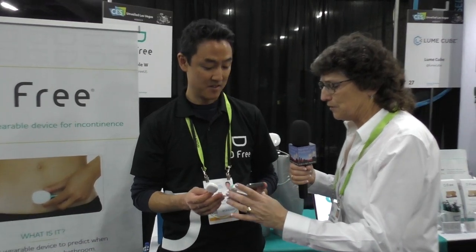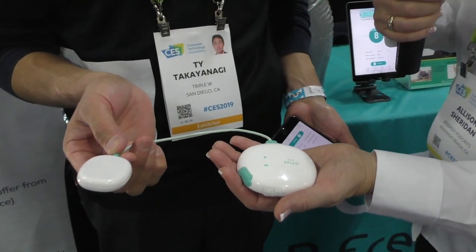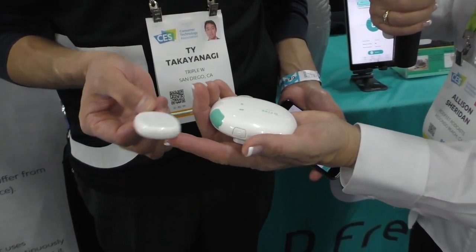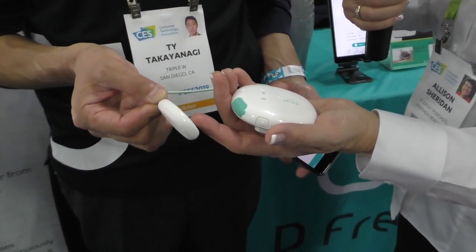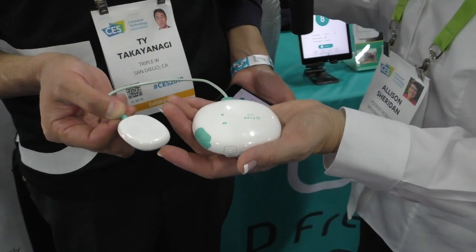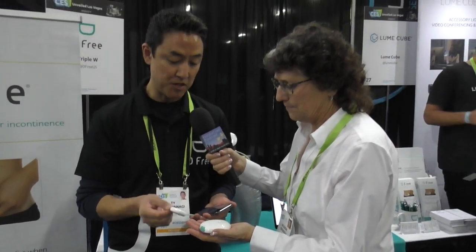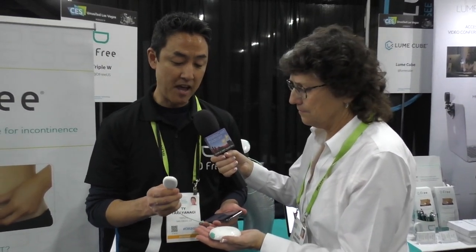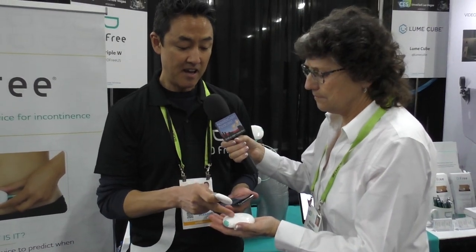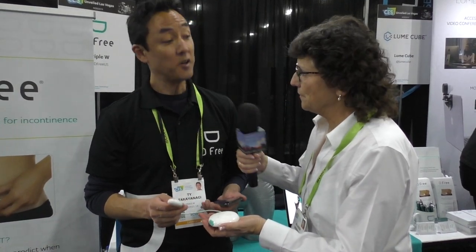Since this is an audio and video podcast, we'll describe these things. You've got two things in your hand: one is a puck that's maybe three or four inches in diameter, and then a little tiny sensor about the size of an Apple Watch, connected by a small cable. This is an ultrasound sensor that you attach to your body and continuously scans your bladder, and this is a data transmitter that uses Bluetooth to communicate with your phone.